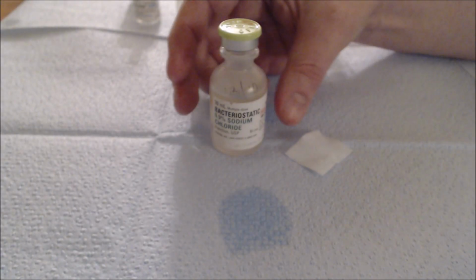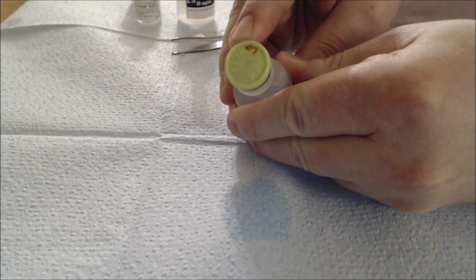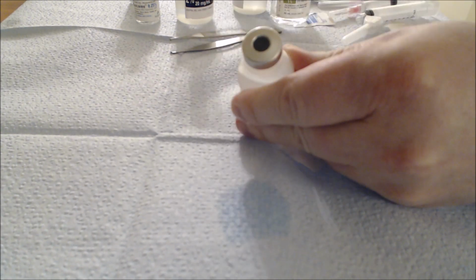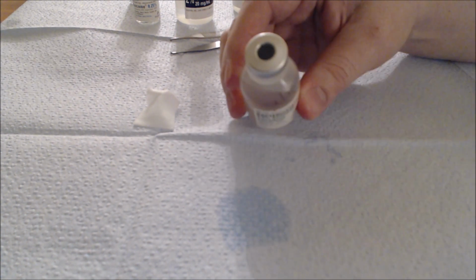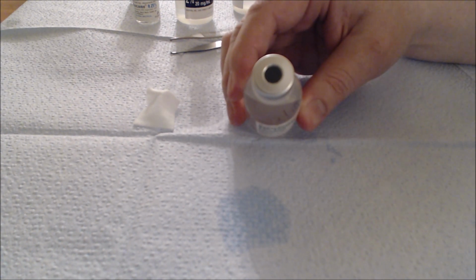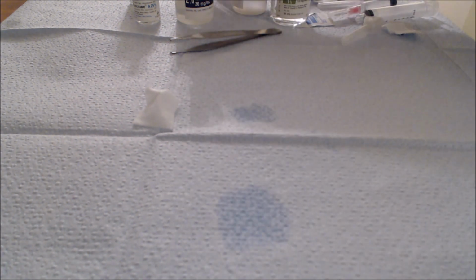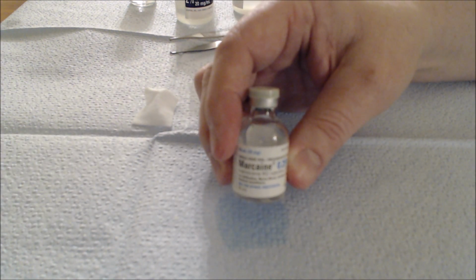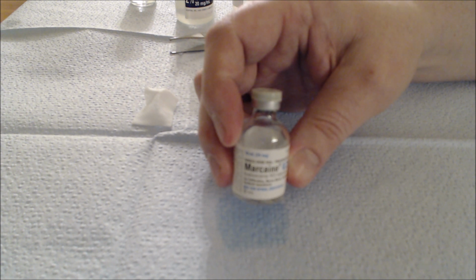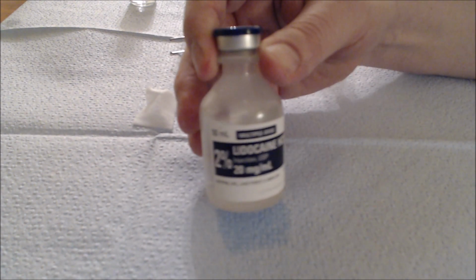If the multi-dose vial that we're withdrawing from already has a protective plastic cap on top and you flip it off for the first time, then you don't need to cleanse the top with alcohol. You only cleanse with alcohol when you're using it a second or a third time later on down the road. This is the difference between multi-dose vials and single-dose vials. Smaller vials are usually marked single dose, and what that means is that you can only use them once and then have to discard them. For the prepper, it's much easier to have multi-dose vials, large 50 ml vials like this one, that can be used over and over again.